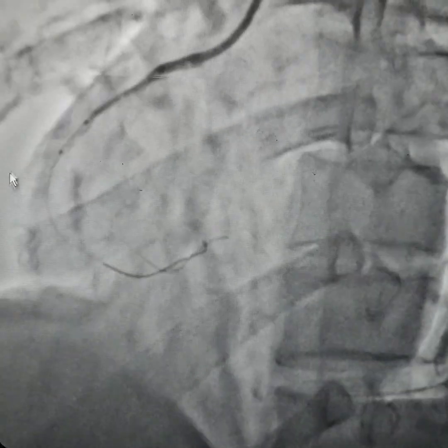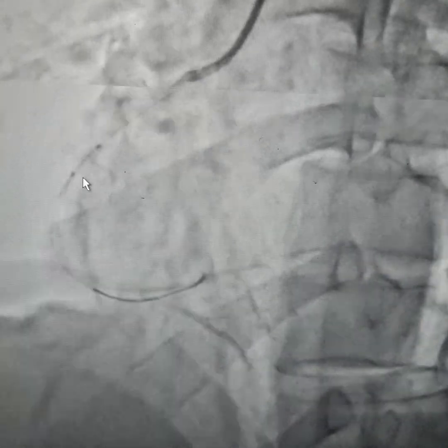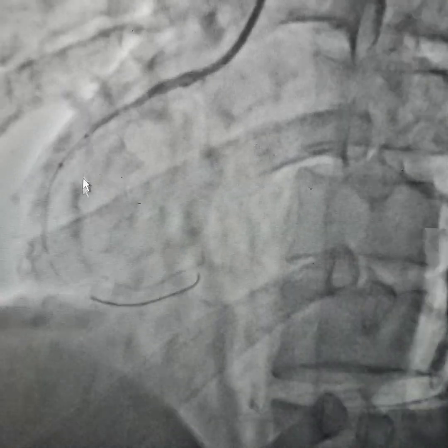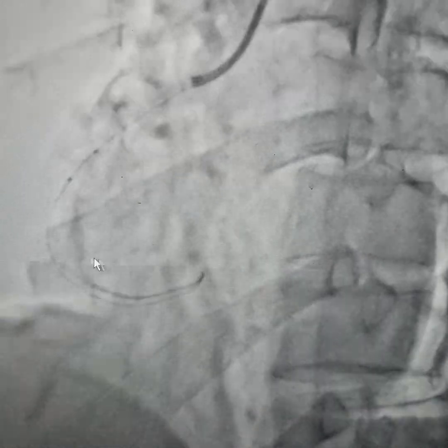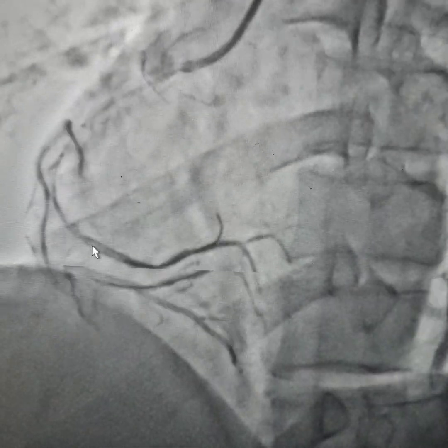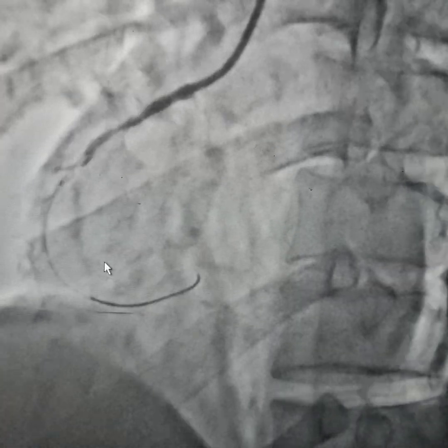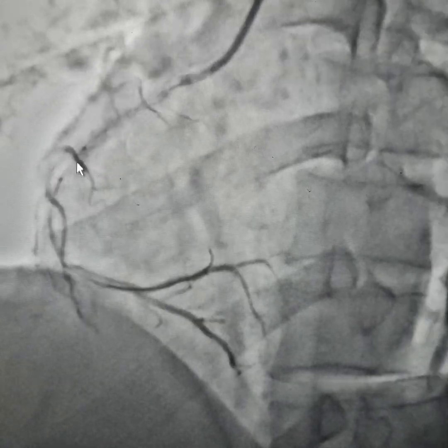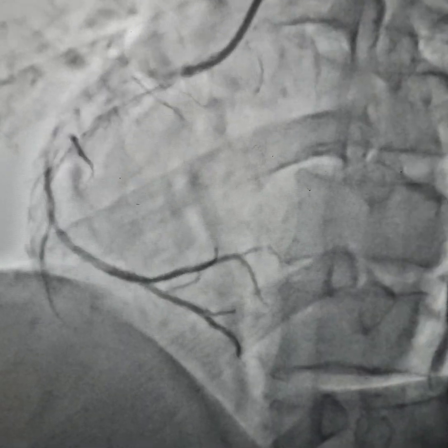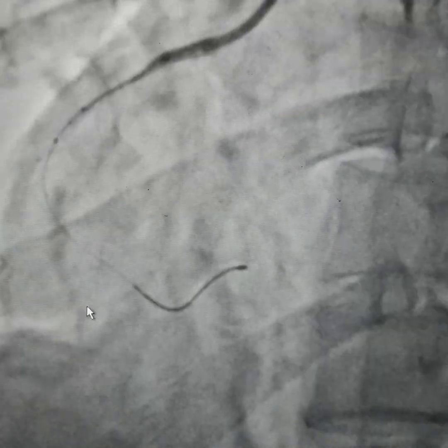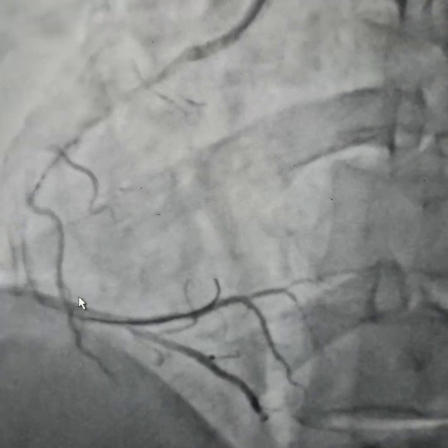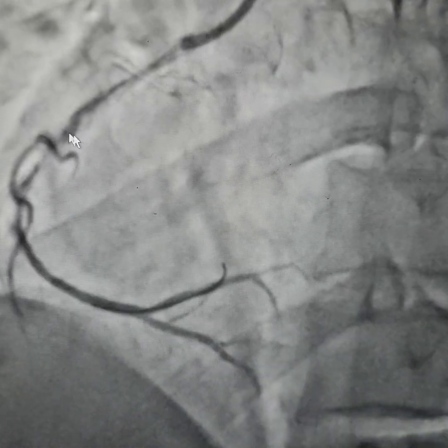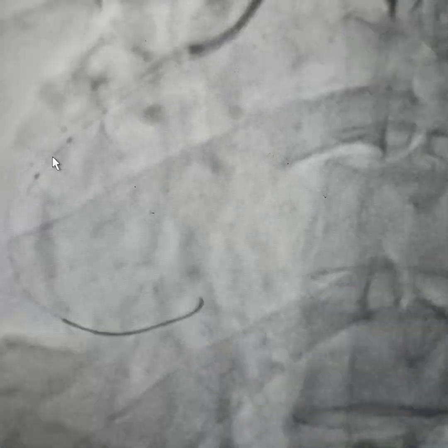We're still measuring the length of the lesion. The strategy is a two-stent strategy. The whole artery is diffusely diseased, but the tightest portion that we've pre-dilated needs to be addressed. We want the first stent to be placed here and then be able to cross this tight portion.